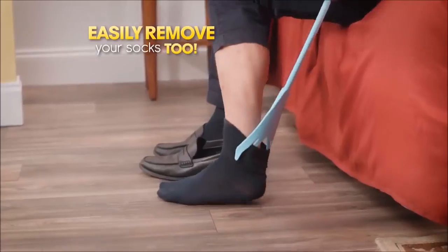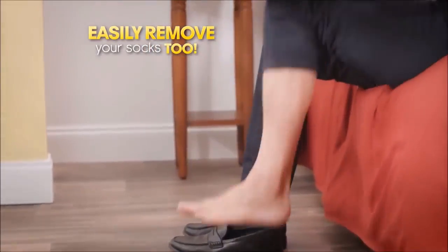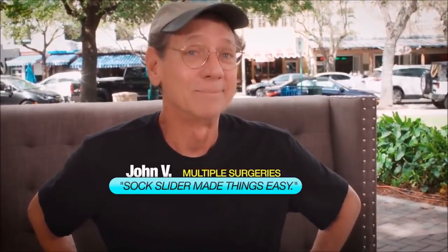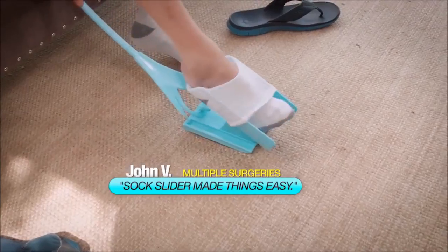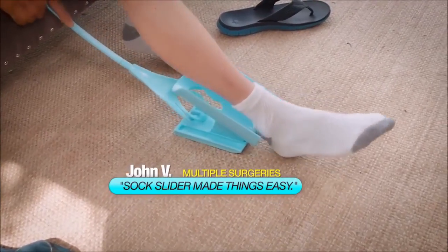Then when you want to take them off, the Sock Slider makes that easy too. I've had everything on me wore out — rebuilt back, shoulders, knees — and the Sock Slider made things easy.